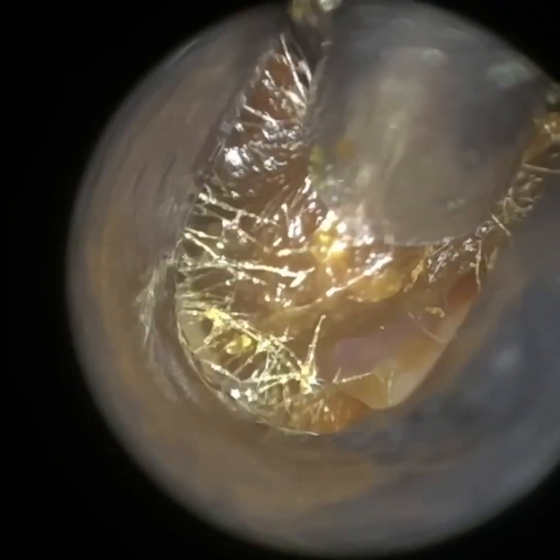I just inserted an ear hook here. Although the ear hook didn't remove this wax — it was really, really lodged — even with the hook it was so lodged that it dissected through some of the wax, which can help remove or at least bring forward some of the wax, because it's in smaller pieces.